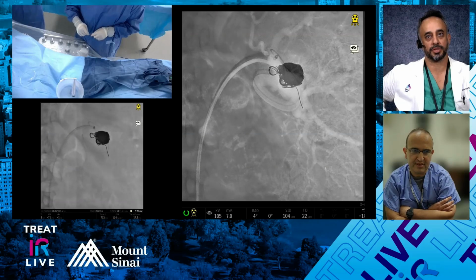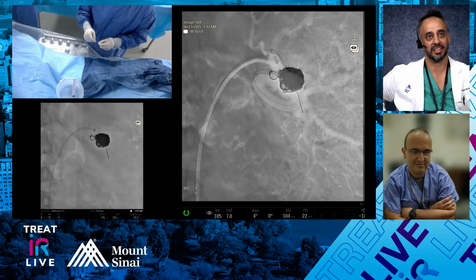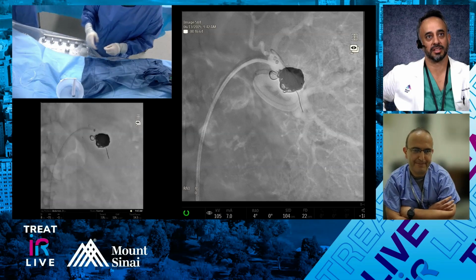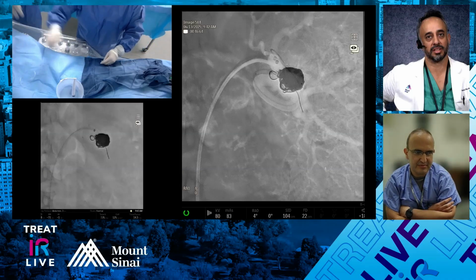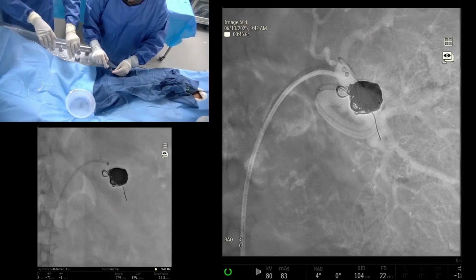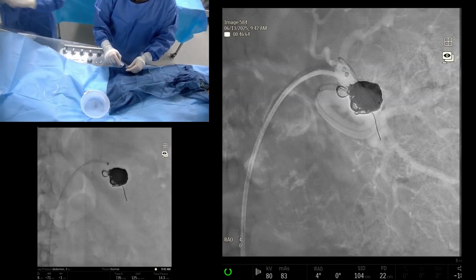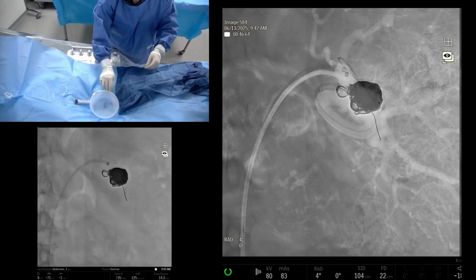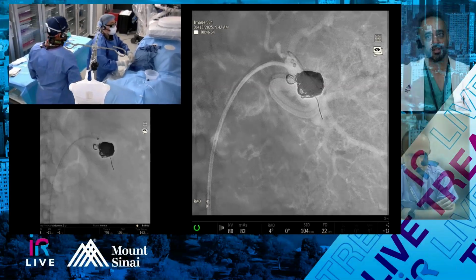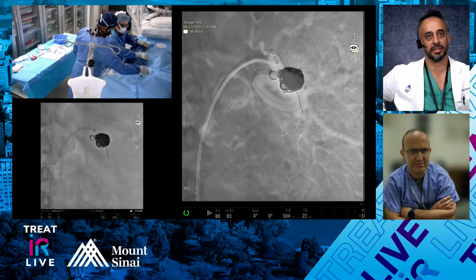It looks like that packing coil just sort of leaked into your aneurysm. And it's just filling up quite nicely, creating a nice dense pack. So what we're going to do is an angio after this. We're going to set up to do an angio after this. Yeah, and maybe I'm just imagining this, but it seems like the coil pack is increasing in density, which is a good sign when it starts clotting, right? Yeah, agree. Absolutely.